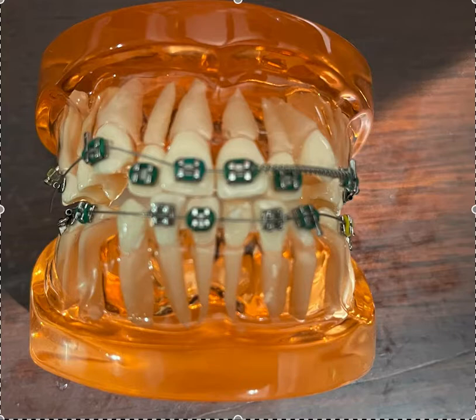Okay, so let's get down to the 018 versus 022 thing. I've used both in practices, and I'm pretty capable of using one or the other. I'll come into a practice or take over a practice, and I just use what they have. As long as I don't use Tip-Edge, that's the one thing. It's a whole different system, a whole different bracket shape. That is not something I'm trained on. It's totally weird and different for me, so no, that's not something I do, nor do I train doctors who want to do Tip-Edge. It's not me. So I just do standard mini twin straight wire.